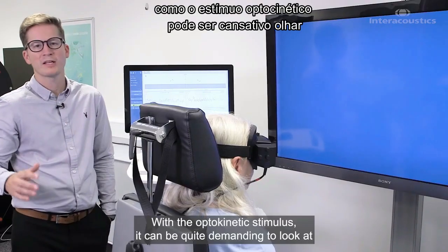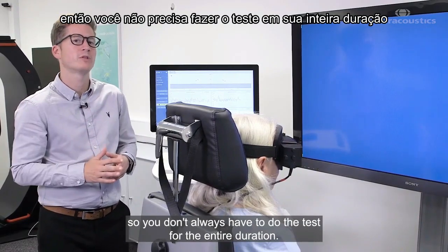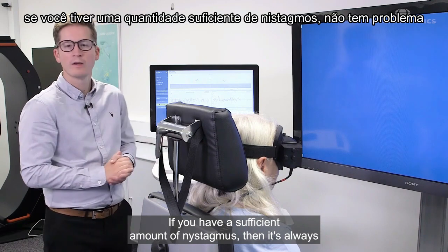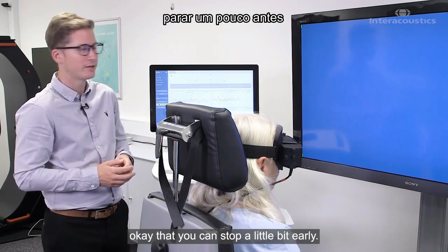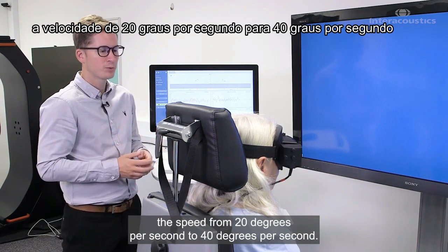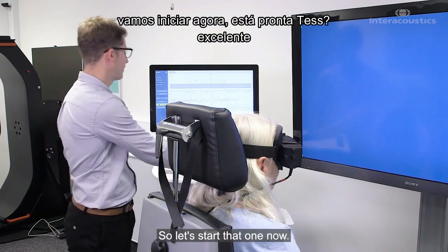With the optokinetic stimulus, it can be quite demanding to look at, so you don't always have to do the test for the entire duration. If a sufficient amount of nystagmus is recorded, it's okay to stop a little bit early. Now that we've done the slow stimulus, we're going to increase the speed from 20 degrees per second to 40 degrees per second.